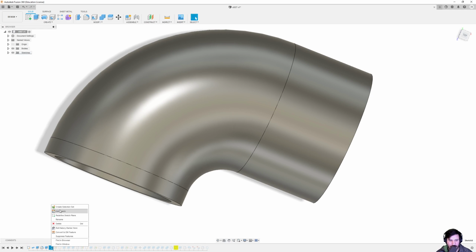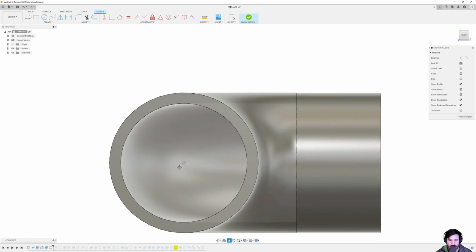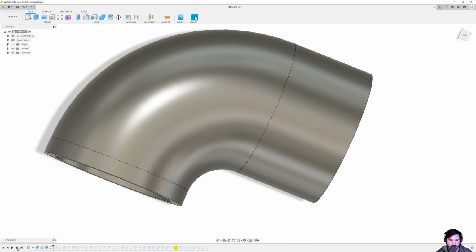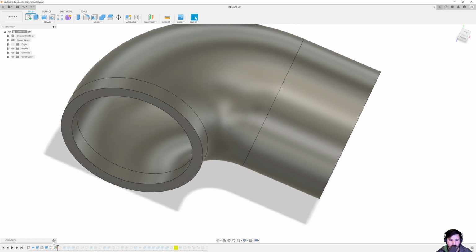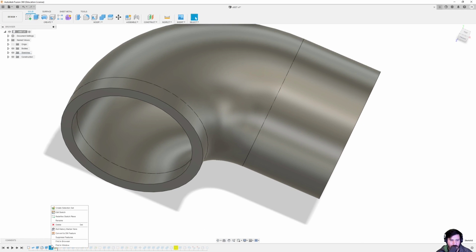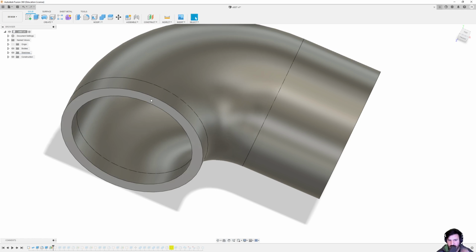And then what I did was I created a sketch along this plane right here, which allowed me to specify some things on here. And so if I go to the next one, let's see, I made an offset plane. So this sketch actually didn't get used, which is why nothing highlighted. This was a sketch that I had done by mistake. So in fact, if I do delete, that shouldn't change anything if I'm not editing it. No, it didn't. So I made an offset plane, basically on this face.